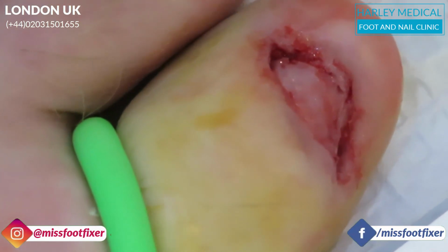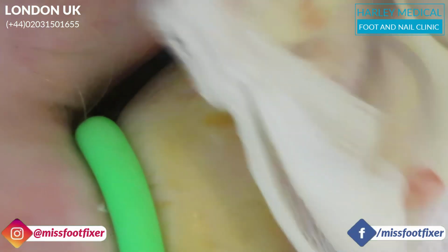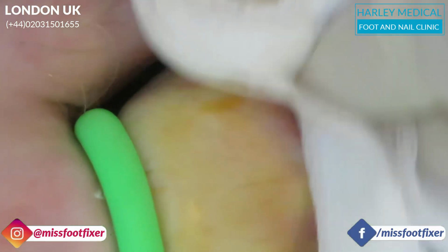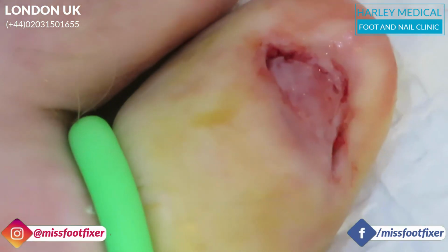Okay. So what I'm gonna do is, I want a 5 blade. Oh, that'd be nice. An older one or one of the new ones? I like the older ones. Really bigger. I don't like these smaller ones. They really are getting pretty small now.